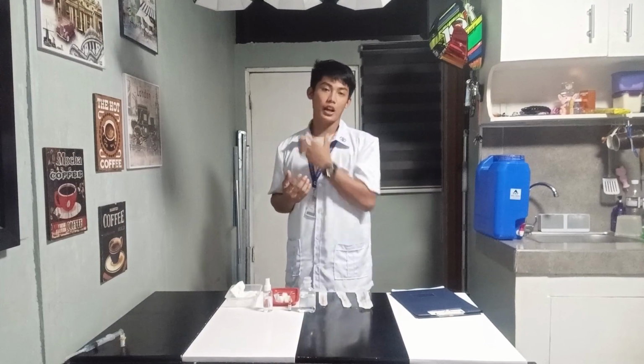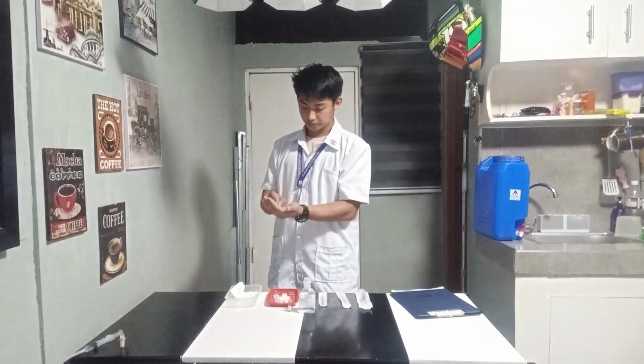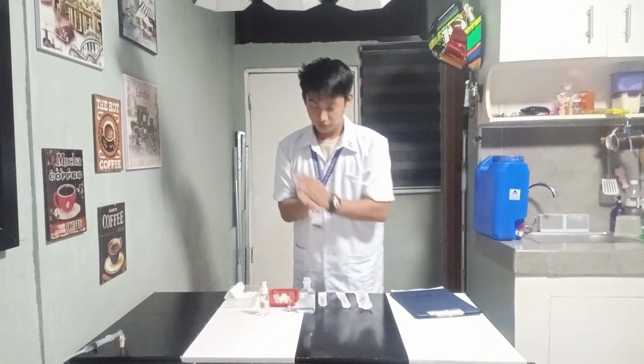Now let's proceed with the preparation of medication. For the preparation of medication from vials, we're going to perform hand hygiene to prevent the spread of microorganisms and to observe other appropriate infection prevention procedures. So, prepare the medication vial for drug withdrawal.